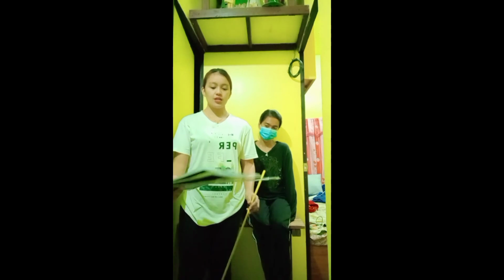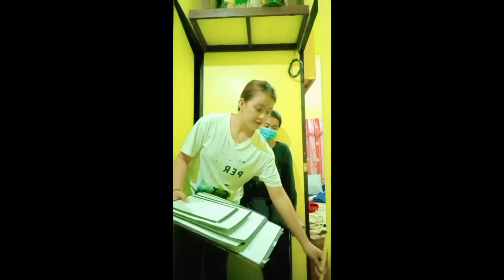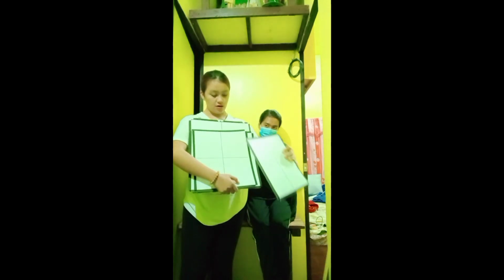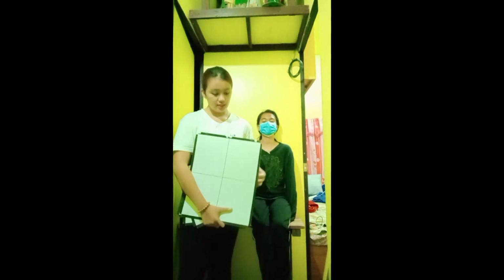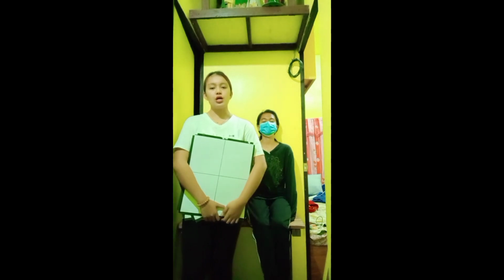I have here the different sizes of the radiographic image receptor. First is the 8x10 size of the IR. Second is the 10x12 size of the IR. Third is the 11x14. Fourth is the 14x14, and the last but not the least is the 14x17 size of the radiographic image receptor that we are using inside the laboratory.